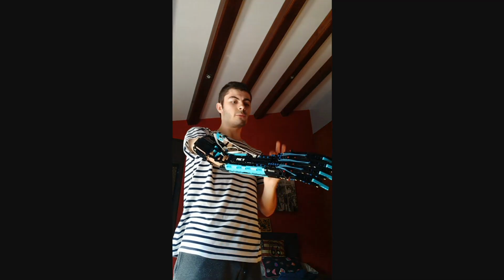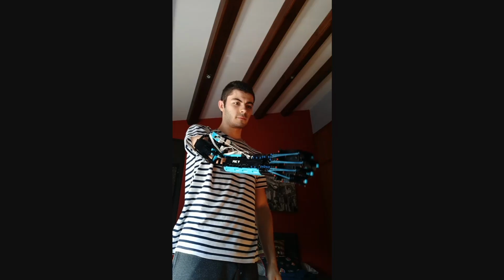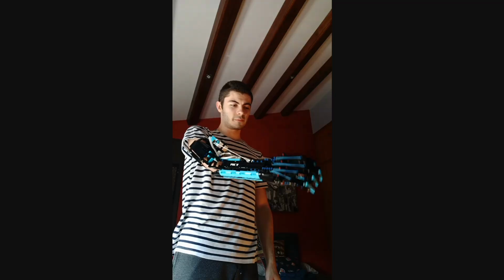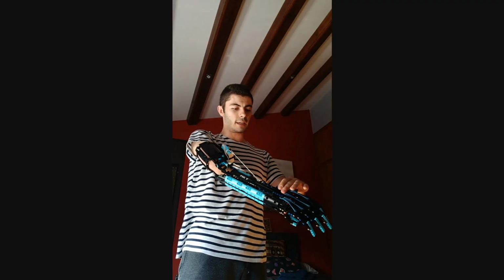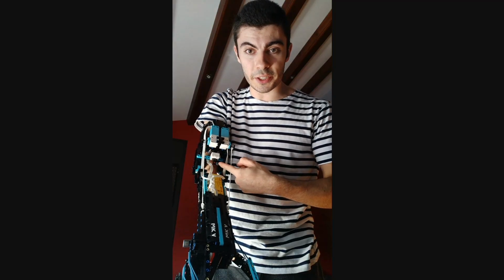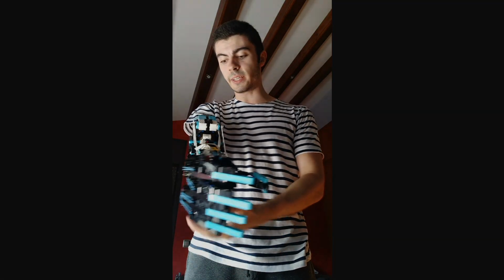And the mechanism is actually really simple. I can put the arm in any place I want, which I think is really cool. It's a very important step in my prosthetic building process. So the prosthetic is really simple to use. The only thing you need to know is that if you push the pressure sensor halfway, you are going up, and if you push it all the way inside, you're going down. So that's the only programming I did on the prosthetic.